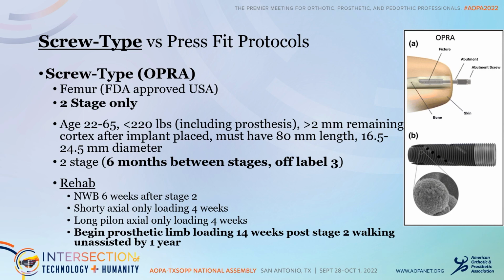As I mentioned, it's a two-stage technique. There's 6 months per the instructions for use and FDA approval between stage 1 and stage 2. However, Walter Reed has decreased that to around 3 months, and some surgeons are doing that in an off-label manner.